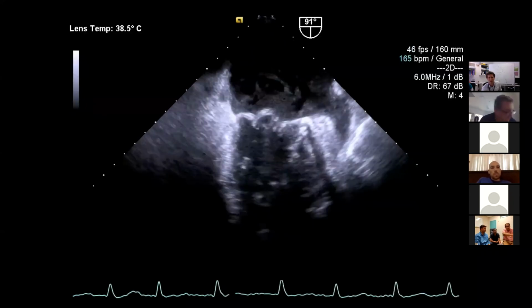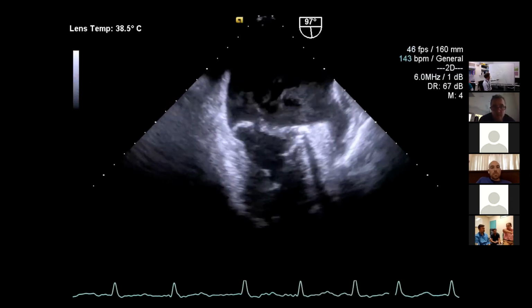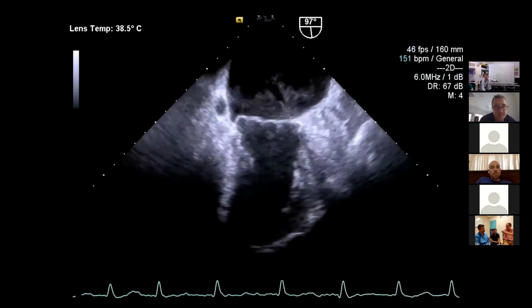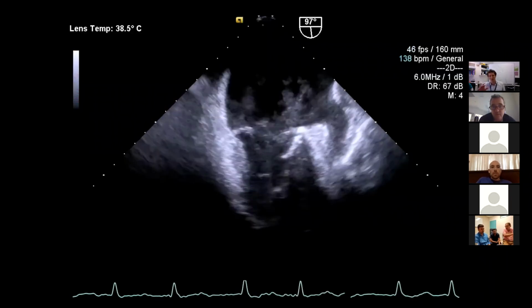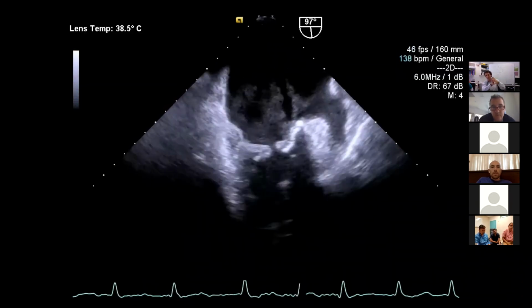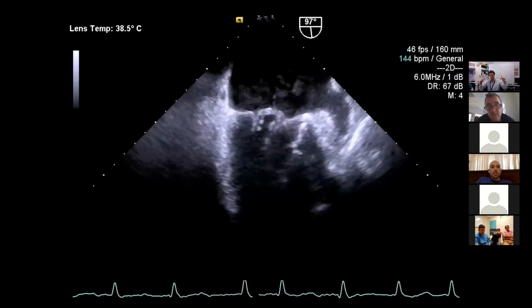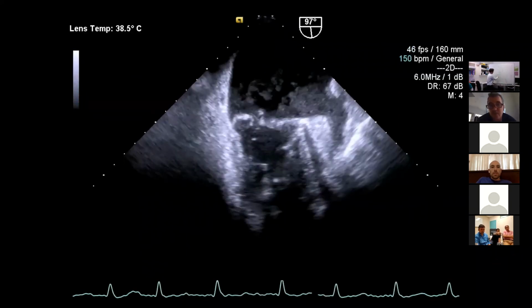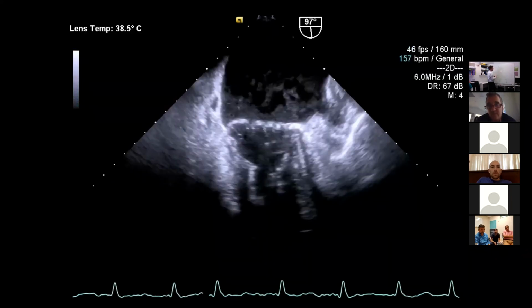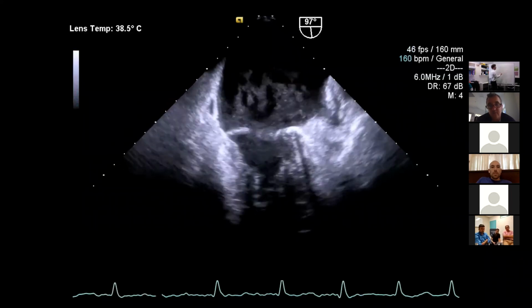Okay. Let's see if we find you. And this is me sitting at 90 degrees, just trying to fan through it slightly. I wish I could slow it down, but what we can see right at the end of the loop is as I was fanning posteriorly. I know it's posteriorly because if you're sitting at this valve in the commissural view, you often get a break between them.